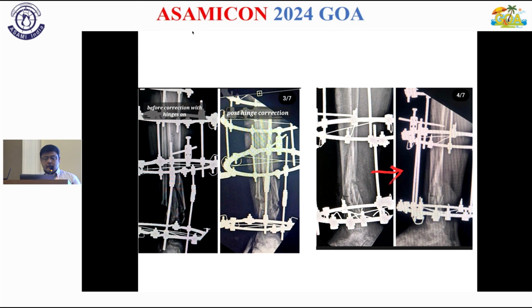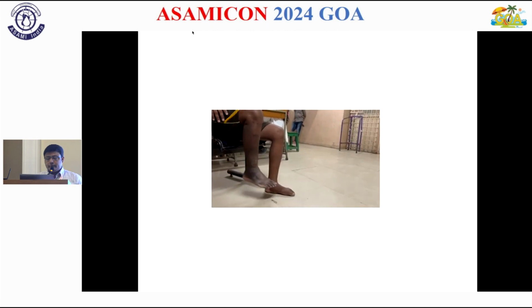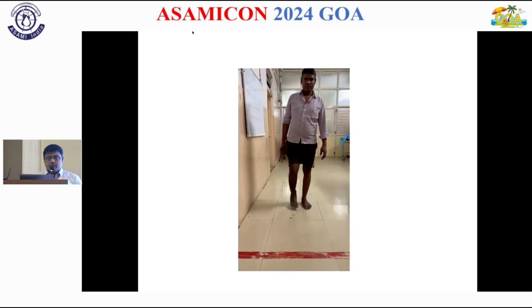It is corrected. You can see in the first image valgus is corrected, and in the second image procurvatum is also corrected. You can see this is the result. This is working, is comfortable. A little limp is there. It is the initial follow-up.